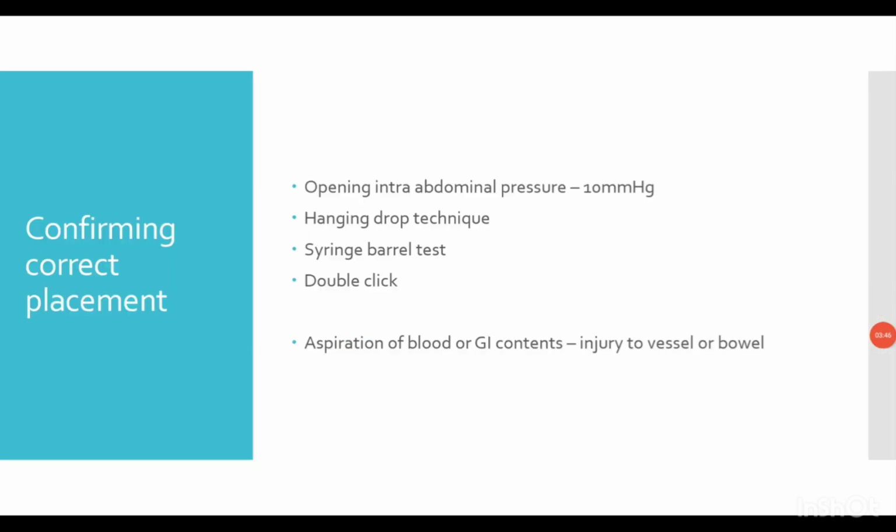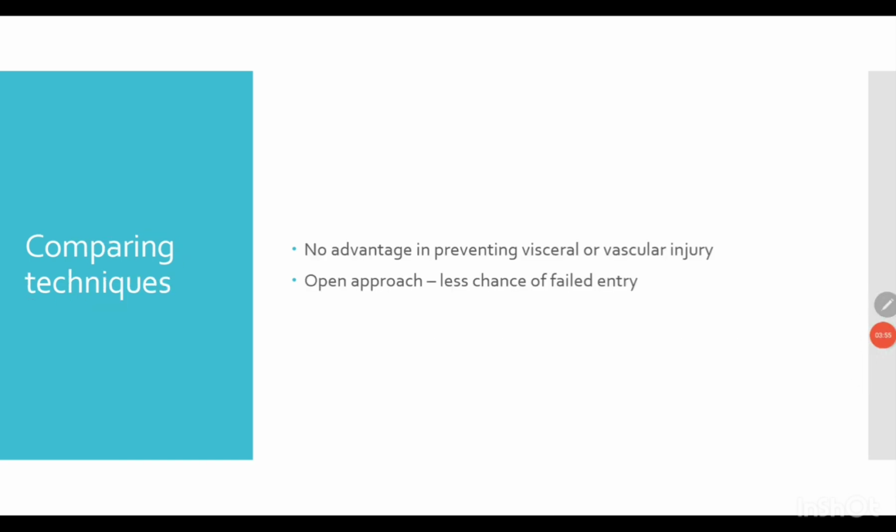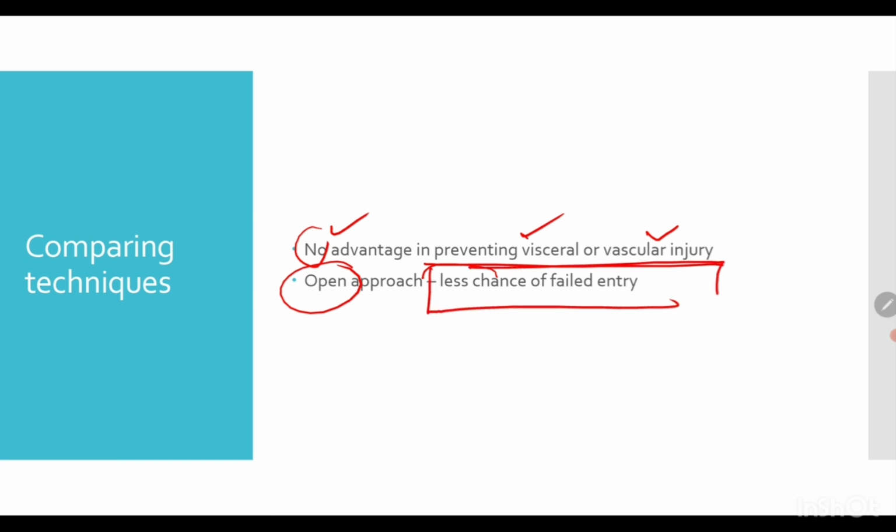What are the correct methods of use? One will check and confirm the correct placement. If you compare both techniques, there is no advantage in preventing visceral or vascular injury by the open approach, but in the open approach there will be less chance of failed entry.